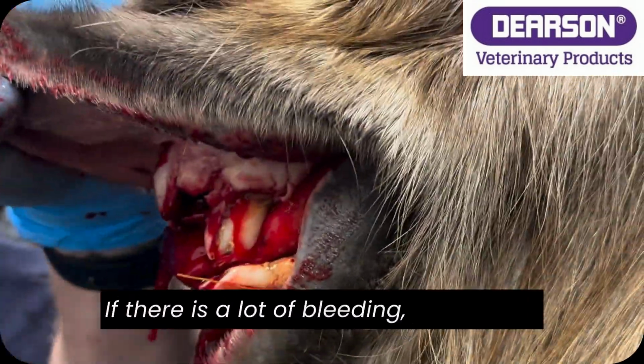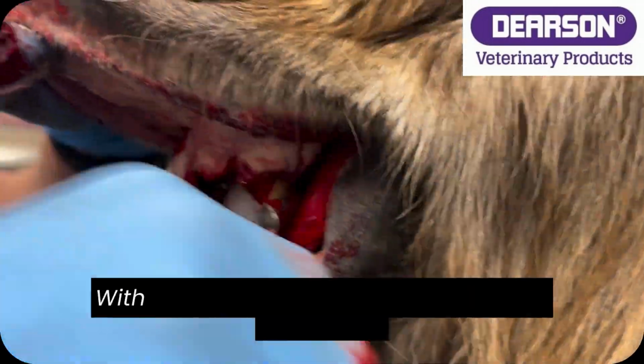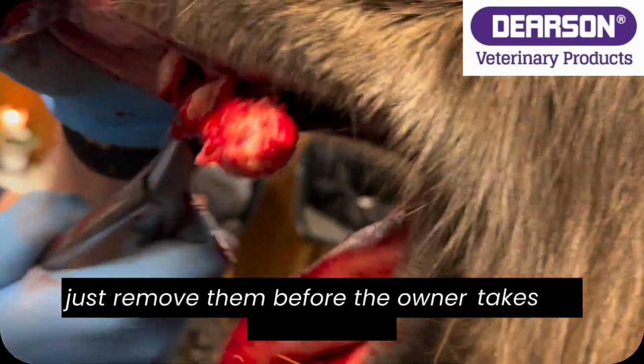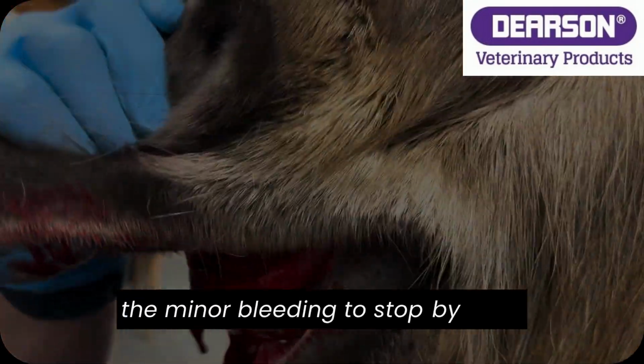If there is a lot of bleeding, I might use Spongostan in the alveoli to try and stop the bleeding. With minor bleedings, I put swabs in the alveoli and just remove them before the owner takes the horse home. But in many cases, I just leave the minor bleeding to stop by itself.